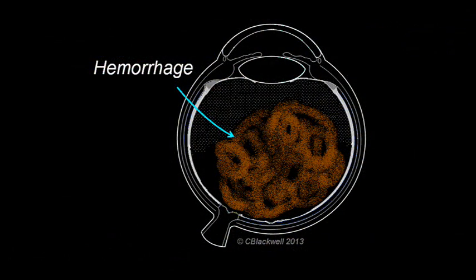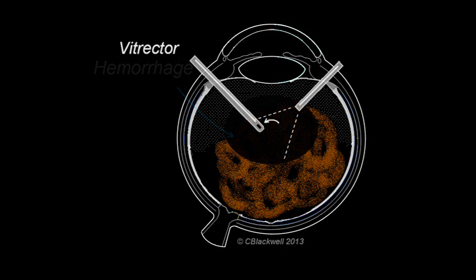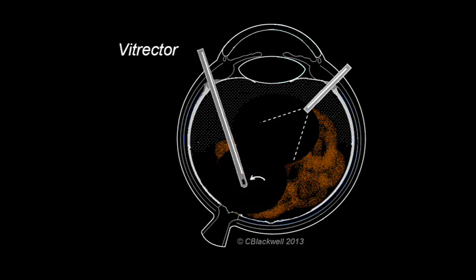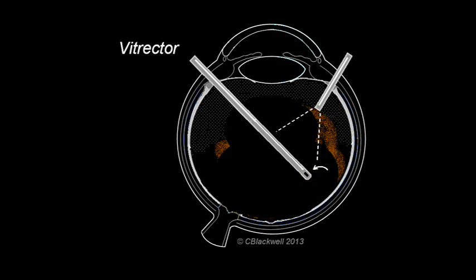We started by discussing vitreous hemorrhage as the motivation for developing vitrectomy surgery. Here we can see the vitrector clearing out the vitreous and the hemorrhage with it. That not only restores vision for the patient, but it allows a view in for the retina specialist.